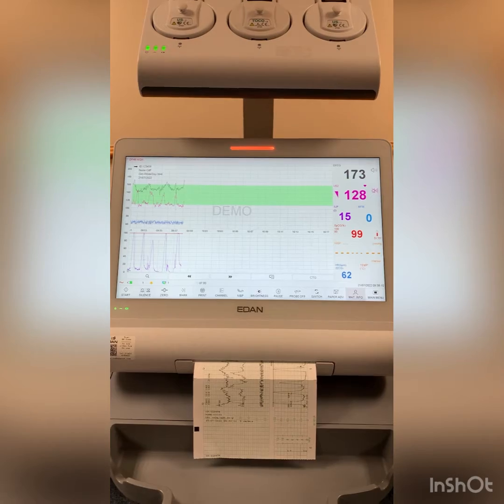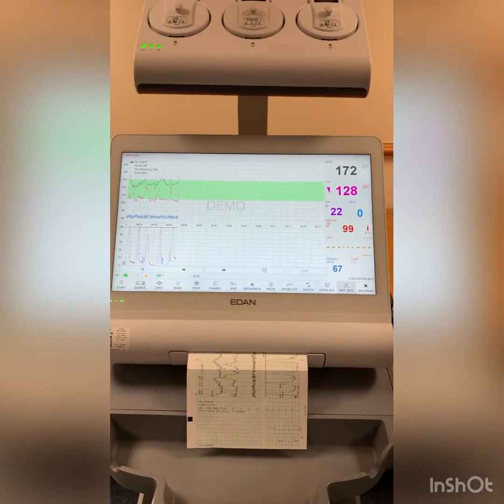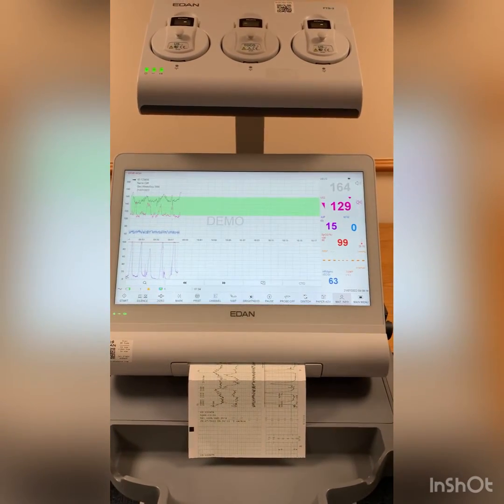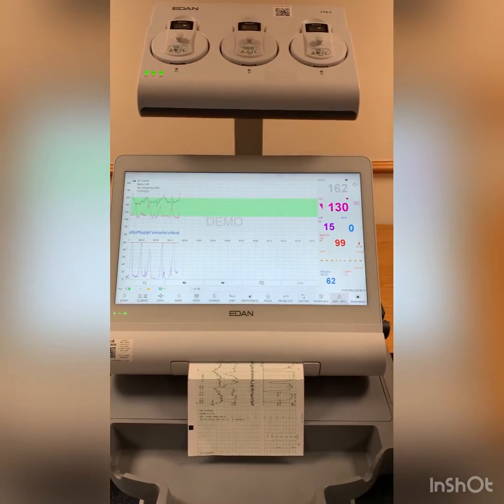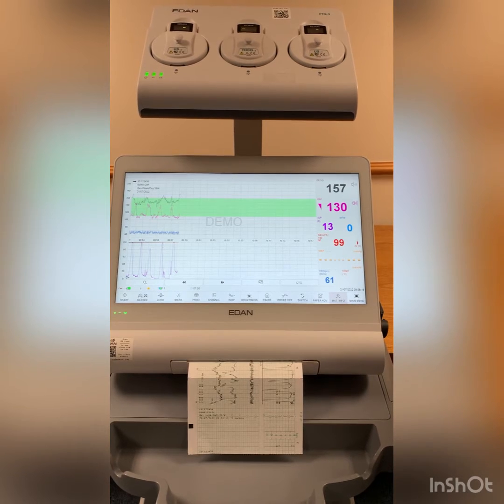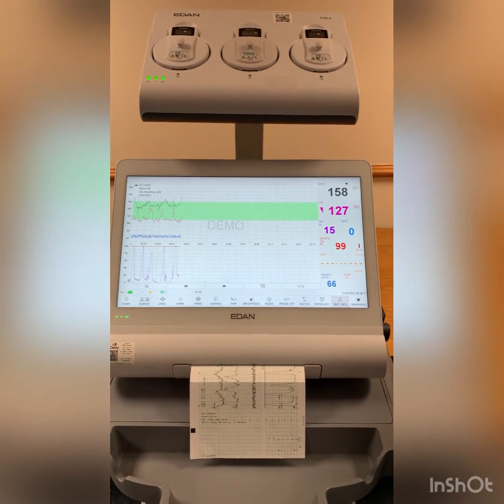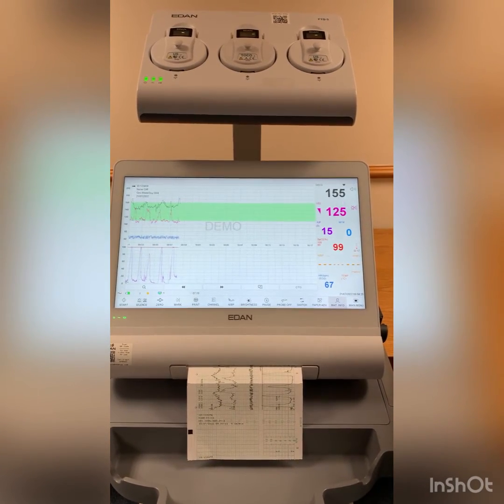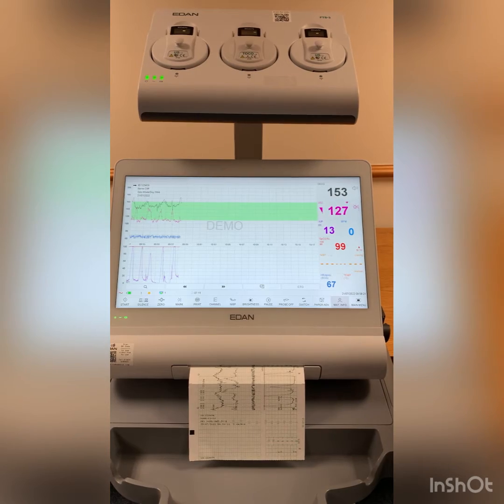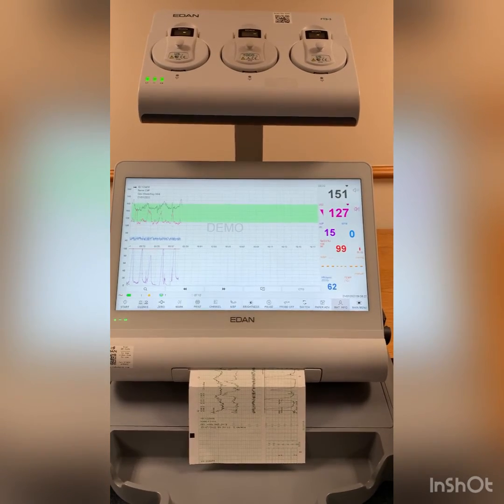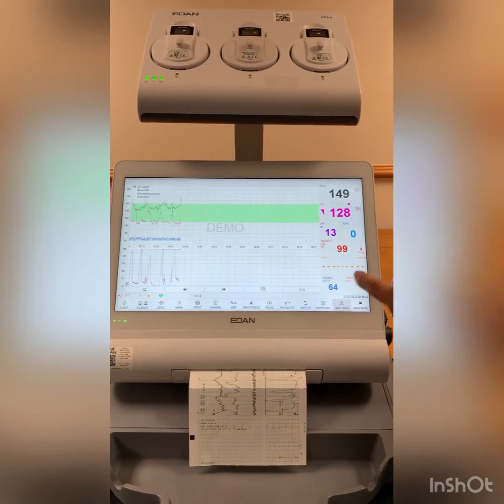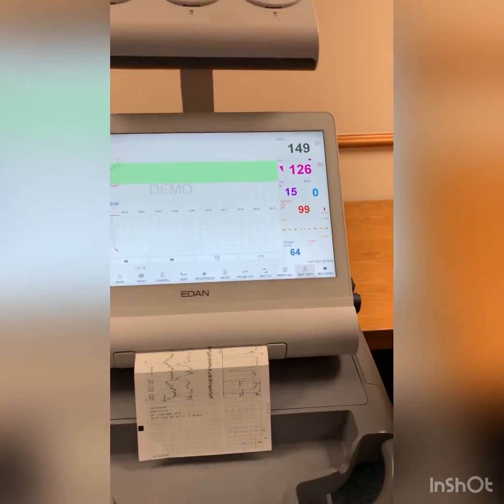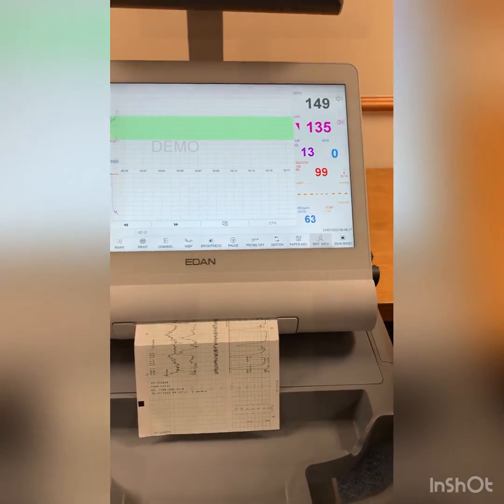The system needs to monitor for a minimum of 10 minutes. We'll come back to it in a few moments when it's about to show us whether the CTG is acceptable and safe. We'll get notified by the system with the CTG button turning green and a beep which accompanies that.